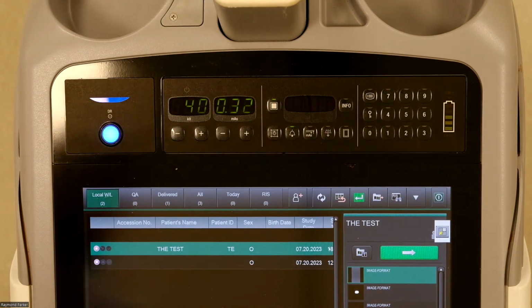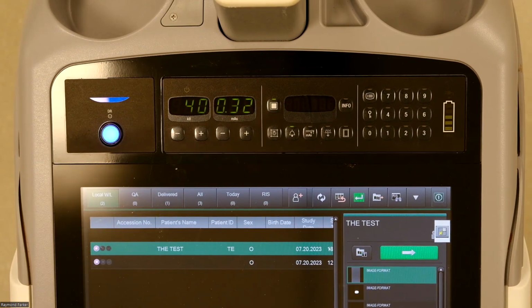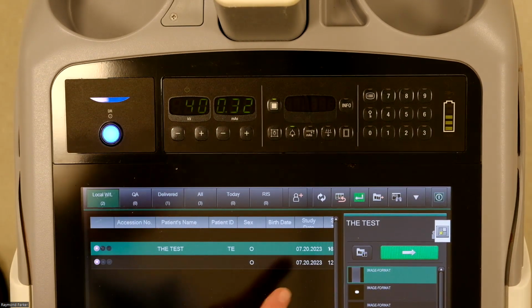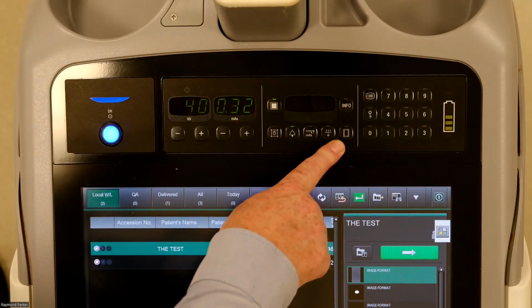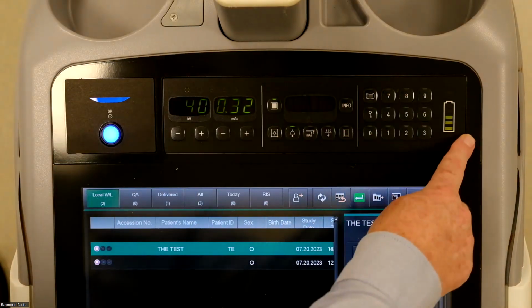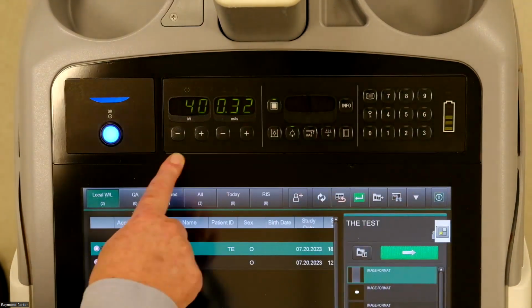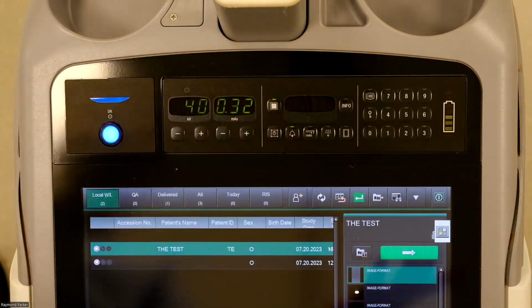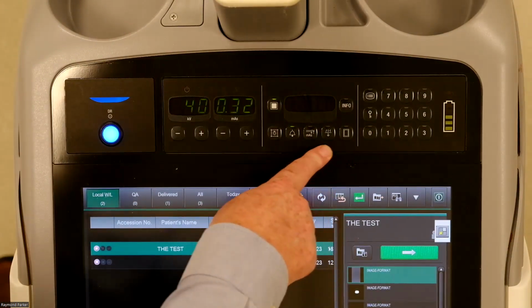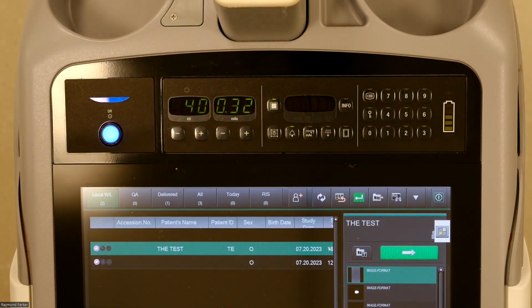I did want to show you a few features in this area, though, just so you can see what I had mentioned earlier, and then one of the most important functions that I can bring to you today. So the first one I want to talk about is our tube warm-ups. Our tube warm-ups are described to be done at least once a day, or when the tube is cold. To do that, there is an actual tube warm-up function embedded in the generator.